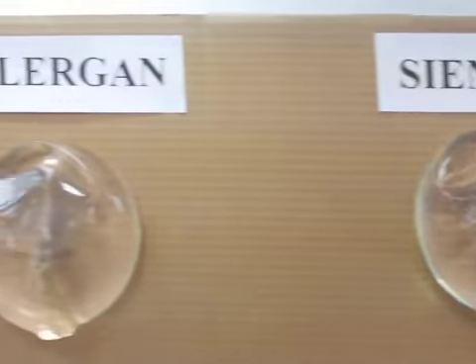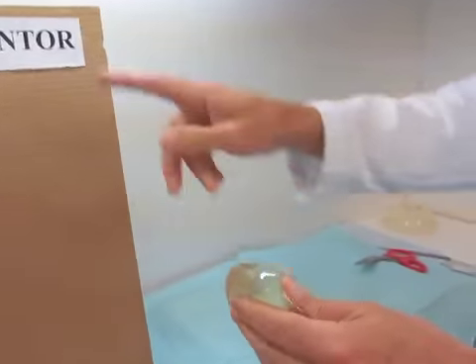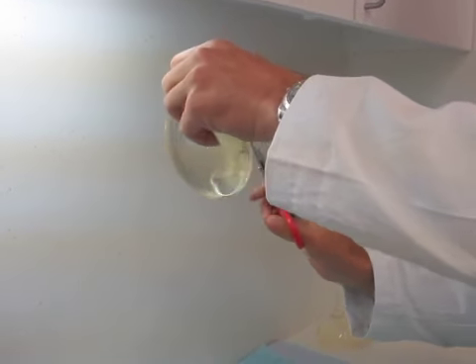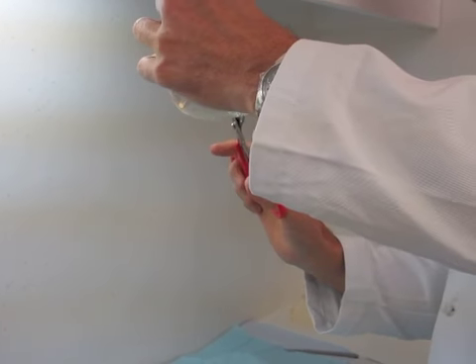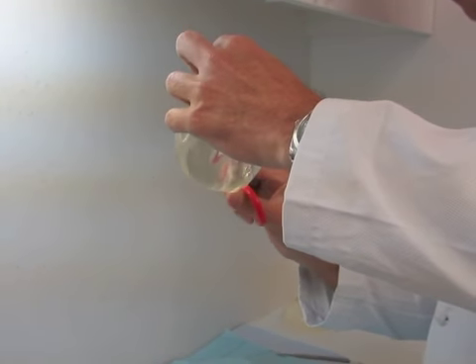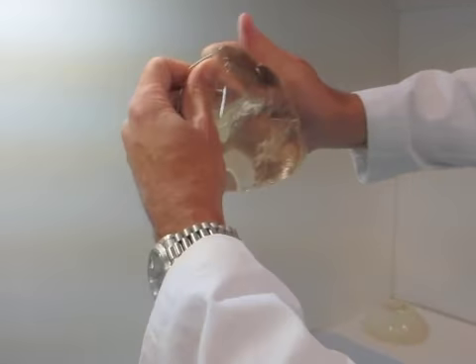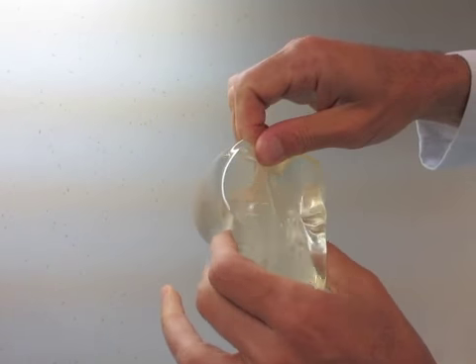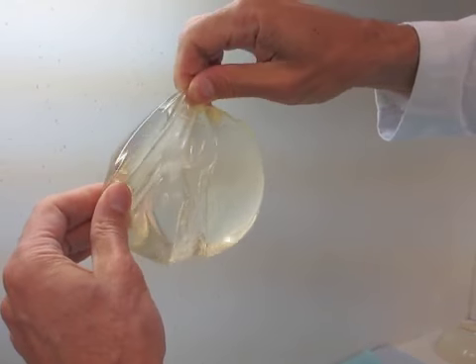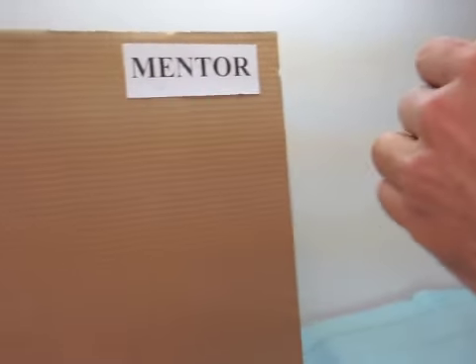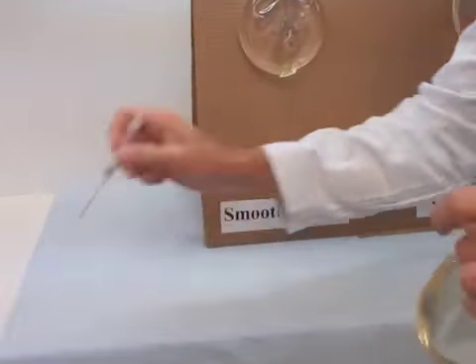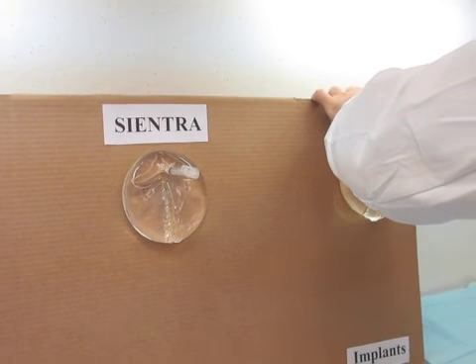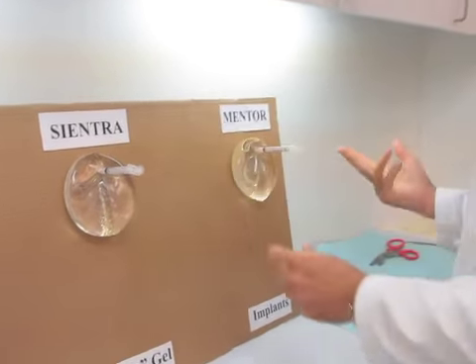And lastly, I'm going to take the Mentor Implant. We're going to do the same thing. Right down the middle. Open the shell up. You can see that's the gel itself. Also relatively cohesive. You'll see it doesn't drip out like water. And we're going to just pin this up here. So those are the three implants.